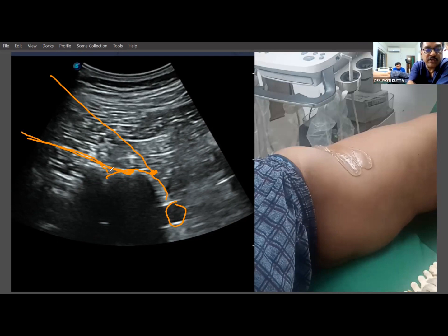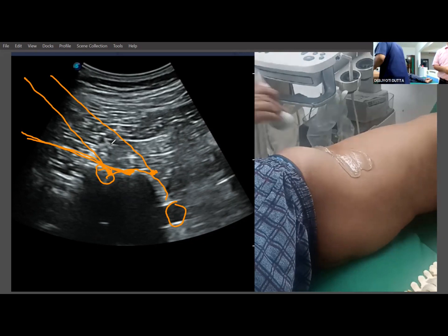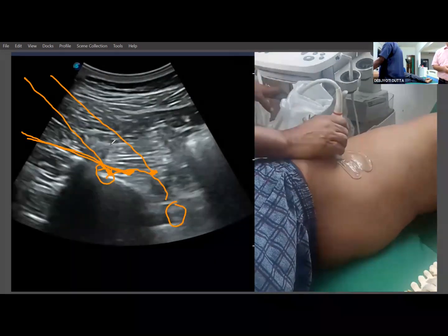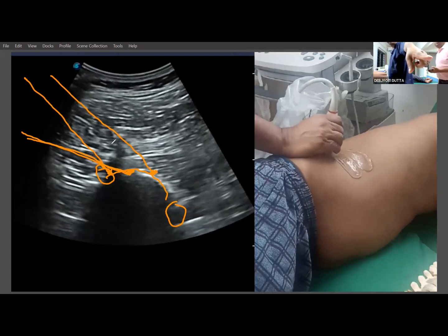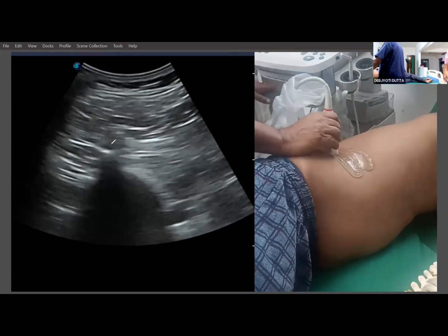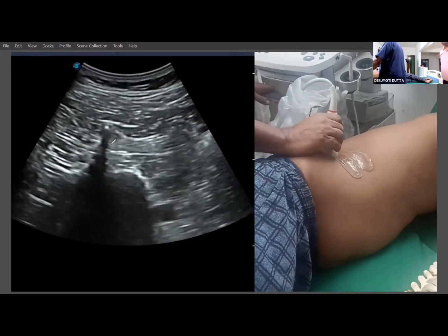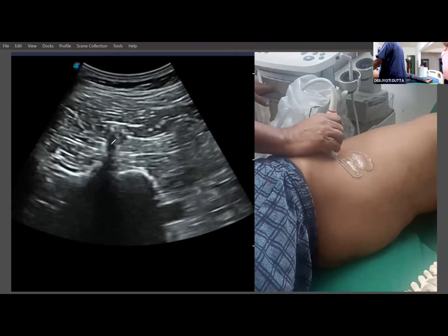Apart from that, what I was showing here is a foramen. So you can think of doing the foraminal injection, though we have not been doing the foraminal injection in this way, but that is an option to come into the foramen. So again, let me show this quickly. You see this view, the transverse process. Annotation clear. So this is your transverse process, then your vertebral body, aorta, a very nice vertebral body.